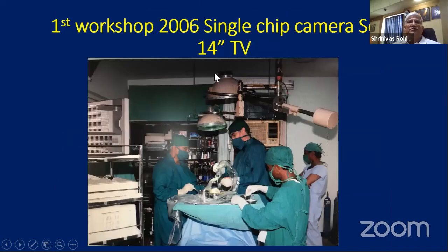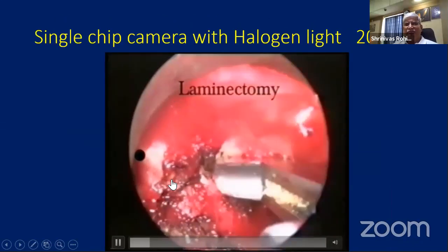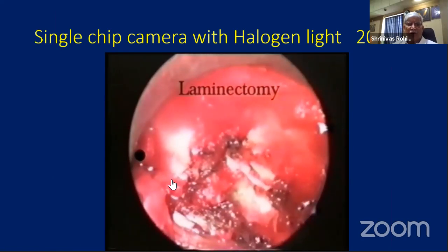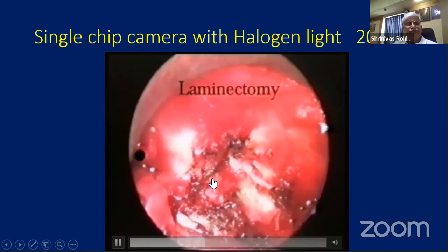This is in 2006, the first workshop. You can appreciate this is a 14 inch Sony TV, 0-degree scope, single chip camera. And this was the video at that time. Mohinder, just let me know how the video is. It's okay, reasonably okay.